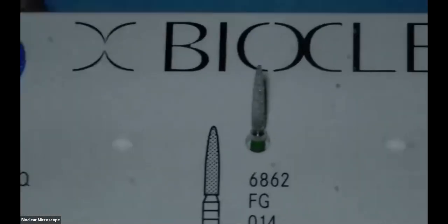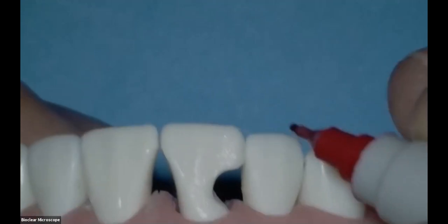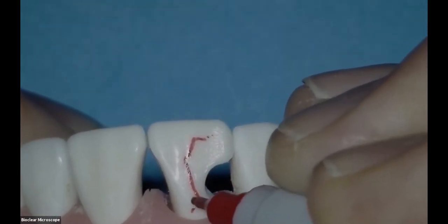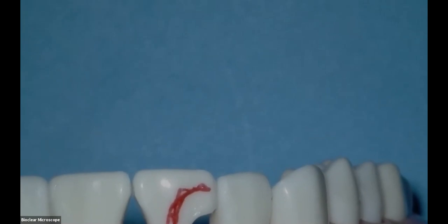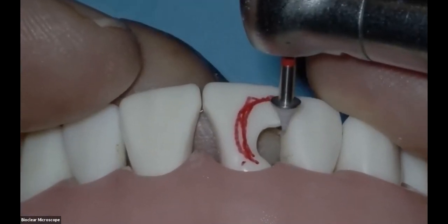So this is the burr kit from Comet, and this is the burr that we could use for the radius bevel. This is burr number 2. So what we want to do with the radius bevel, and this is part of all of the learning center curriculum that we teach, is the radius bevel needs to be about the same width as the deficient tooth structure here. So my radius bevel is going to be about that big, and that allows us to blend the restoration. You can do this with different burrs, but this burr is specifically built for the radius bevel.